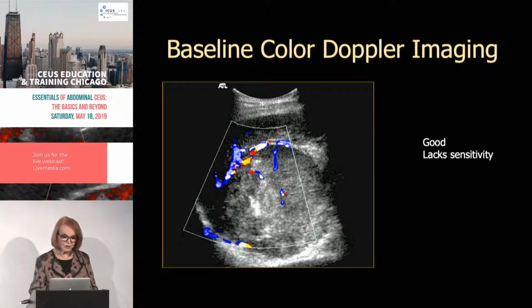So I thought I would just show you one of the very first cases that I did with Peter Burns. Although we're not to ever have equipment logos on our machine, I left this one on because you will see that this is on an ATL ultrasound machine. So this is really historic. The pulse inversion wasn't even implemented yet, and ATL was not purchased by Philips. So this was a young man that was sent to me, a university student with this liver, with this great big mass.